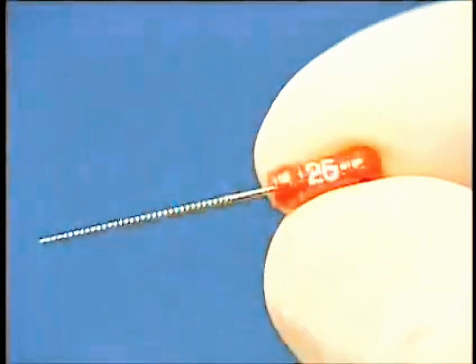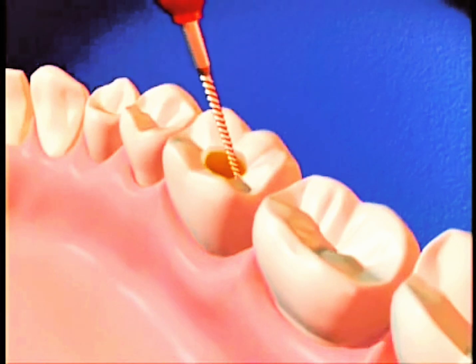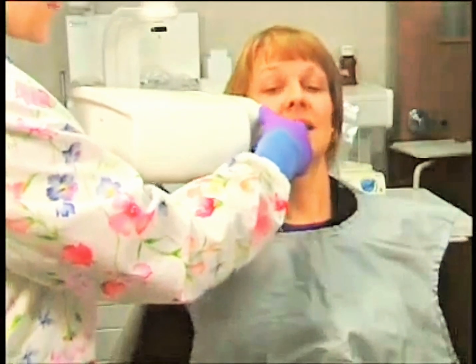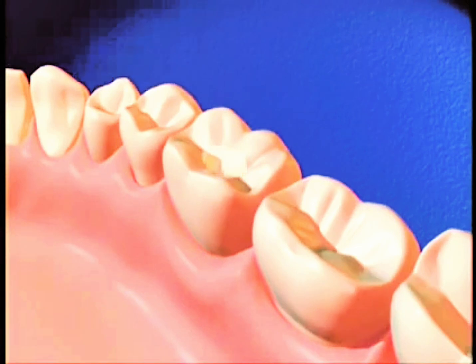This is a dental file. We use it to carefully clean out the infected tissue and shape the canals to receive the filling material. We take x-rays to make sure that all of the infected pulp is removed. After placing the filling material, we then simply place a filling in the hole in the crown.